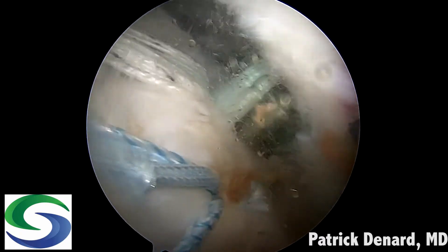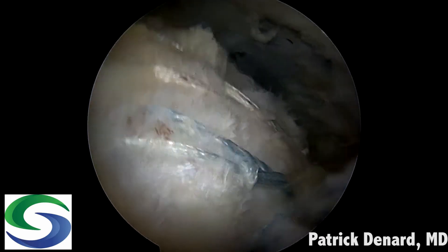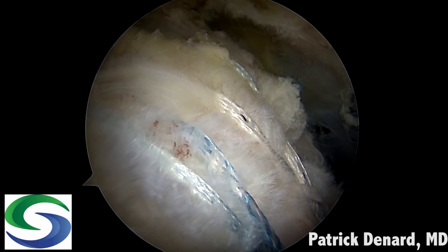We then repeat the process anteriorly, incorporating the tiger tapes and the fiber link suture anteriorly. This completes our knotless ripstop repair — a low profile knotless repair for poor quality tissue.